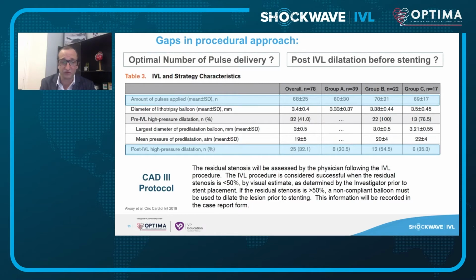If we go to the CAD3 protocol, it was mandatory for the operator to post-dilate after IVL if there was a residual stenosis of more than 50%, and maybe we can use this definition to have a comparison between the studies.